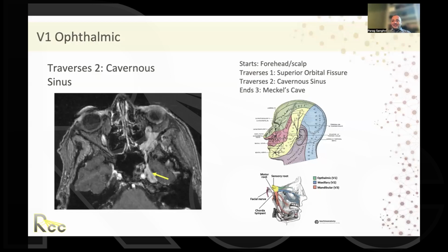One of the key things I say in my trainings all the time, especially for PNI, when you're looking at imaging, whether it's a CT, an MRI, or a PET scan, it's about symmetry, symmetry, symmetry. So compare to the contralateral side, and you will see subtle changes, expansion of the bony canal, mild enhancement that you see on an MRI should really make you suspicious that there's perineural invasion here.